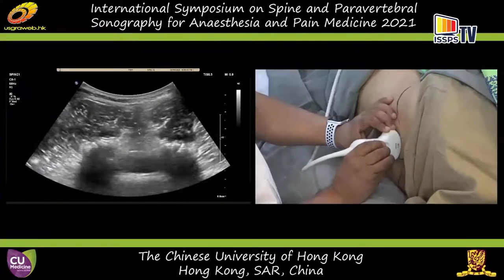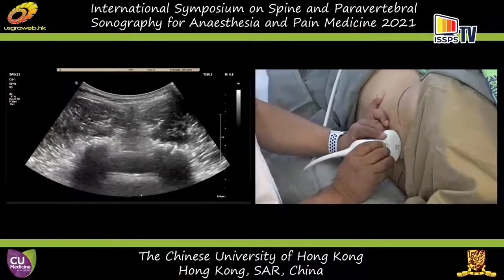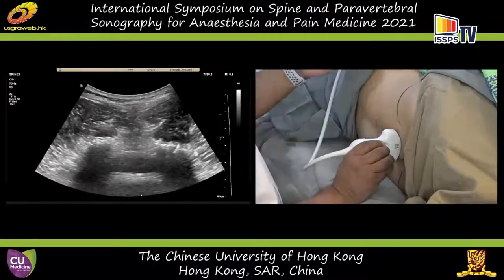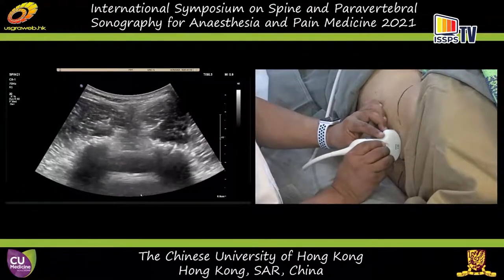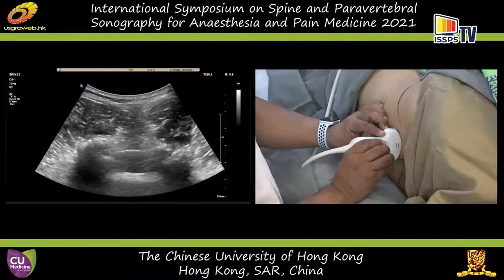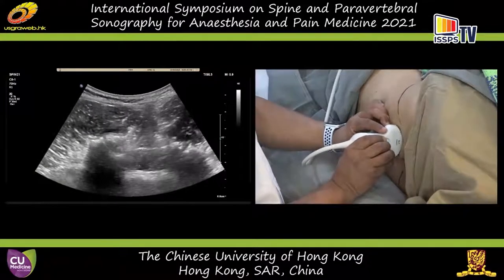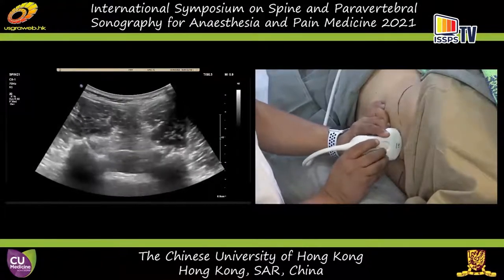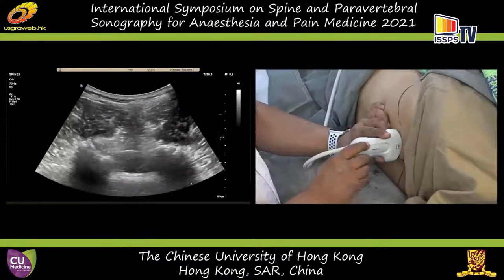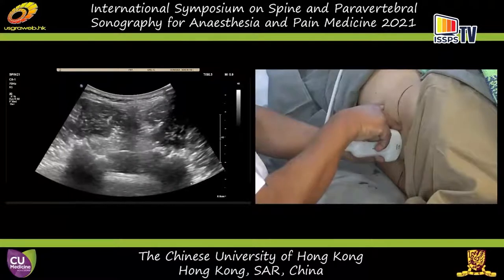You can go further up — this is your L4-L5 transverse interspinous view. On the dependent side, which is his left, you can see the facet joints very nicely — the articular processes — and possibly the facet joint with the hypoechoic gap there. You can see the posterior dura and the anterior complex. If I were to do a spinal injection here, for dexterity you can do it from this side, but it is going to come from the non-dependent side.